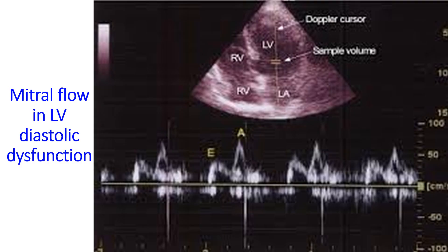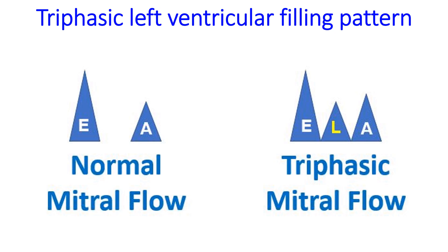The upper half of the image shows the apical 4-chamber view of the heart. The Doppler cursor and sample volume are seen along the midline of the left ventricle. The lower half shows the Doppler flow pattern across the mitral valve, with time on the X axis and velocity in centimetres per second on the Y axis. A triphasic left ventricular filling pattern with an additional mid-diastolic wave — called the T wave or L wave — can occur in left ventricular diastolic dysfunction, especially in hypertrophic cardiomyopathy. Another video on this channel describes triphasic mitral flow in more detail.